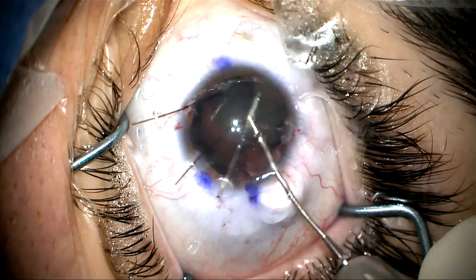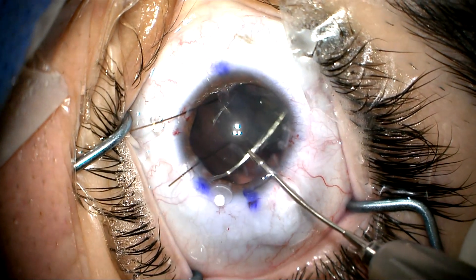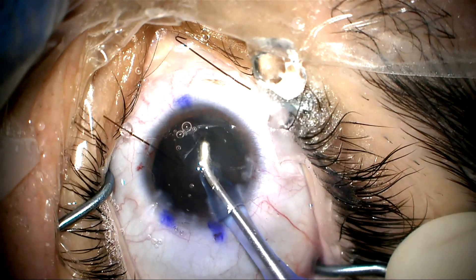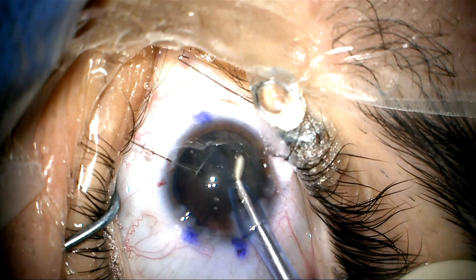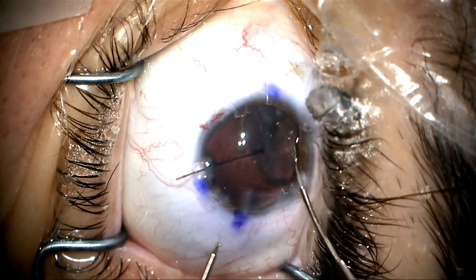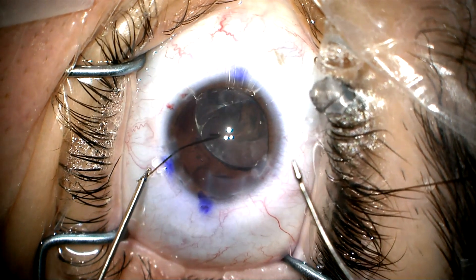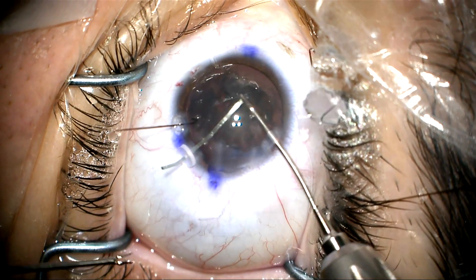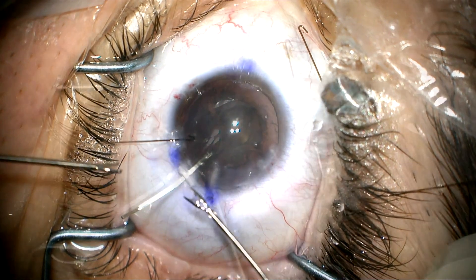I can't reach the eyelet of the capsule tension segment with the iris hook — it's not long enough. So I'm going to try to use a capsule retractor to pull the whole bag over, but it's not long enough either, and when I try to hook the capsule bag, it ends up completely in the eye, so I have to take it out. I made a decision: I'm going to remove some of the cortex and lens material in the bag so I can see the eyelet of the capsule tension segment better. I'll inject a little bit of dispersive viscoelastic to elevate it, then come from a slightly different angle, grab the capsule tension segment, pull it over, and hook it with my other hand. Now I can pull on the capsular bag and bring it over using the capsule tension segment to stabilize it. I'll add another capsule retractor and now I can reach the equator of the bag and really stabilize things.